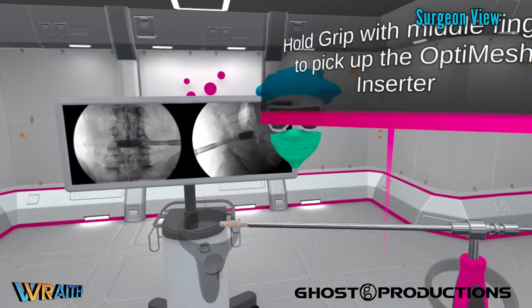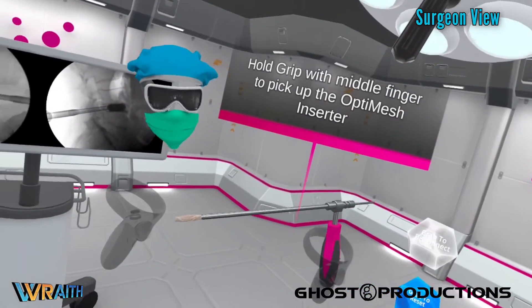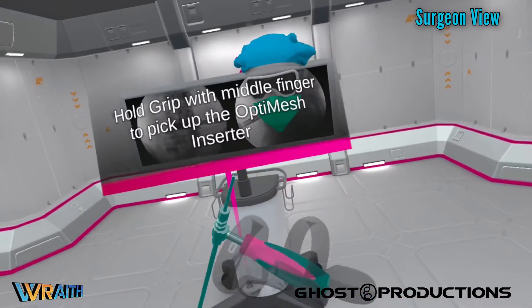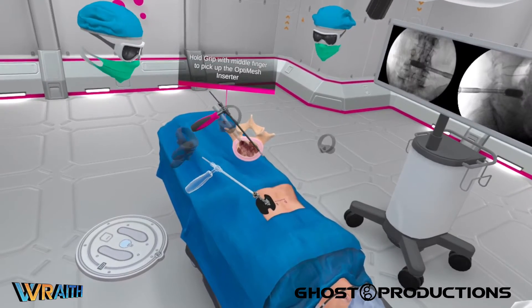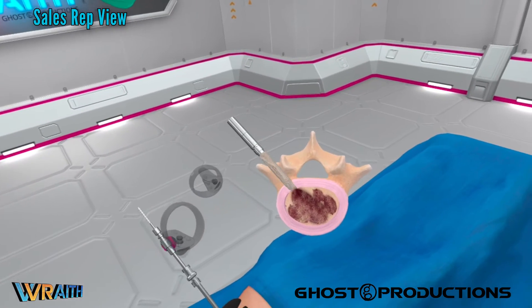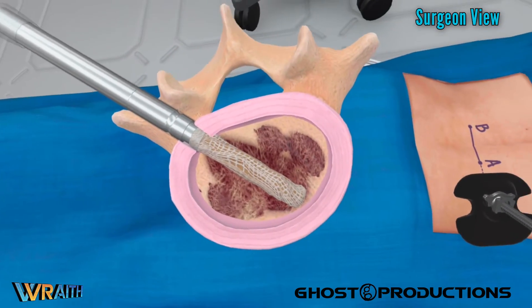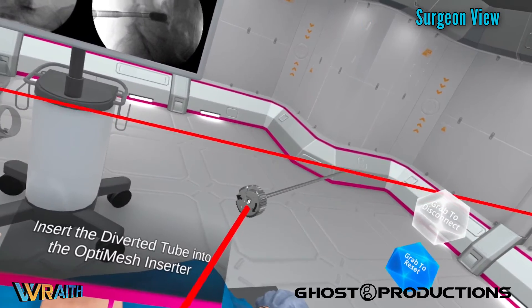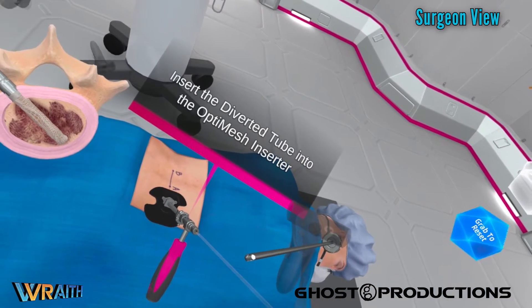This is our Spinalogy OptiMesh graft containment implant, loaded on the end of this inserter tool. The graft containment is a mesh material, and the inserter allows the user to put bone graft through it to expand it in the disc space. If you put this into the disc space, we'll see it in the mimic here — get a good view of the mesh. This is the unexpanded mesh. This is a series of preloaded tubes with bone graft inside. If you look at the distal tip, you can see there's a little spoon-shaped diverter that will help direct where the bone graft goes inside.